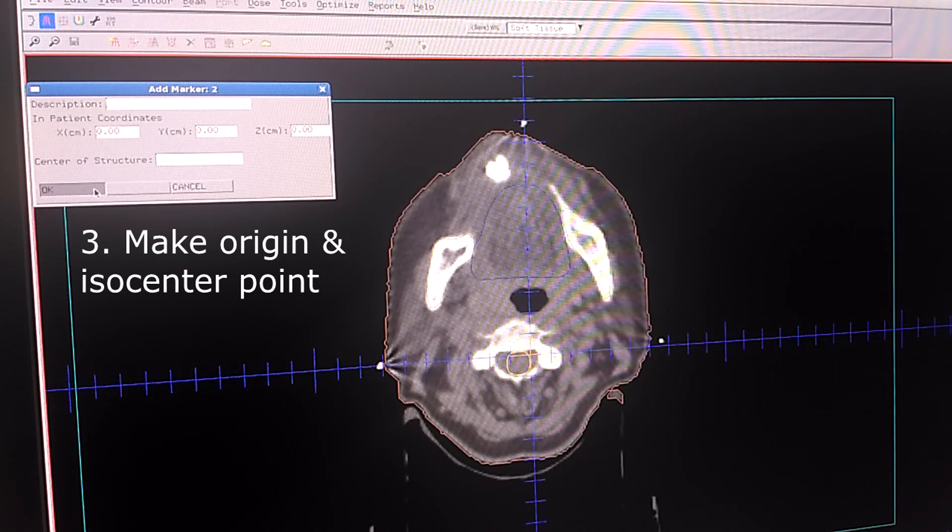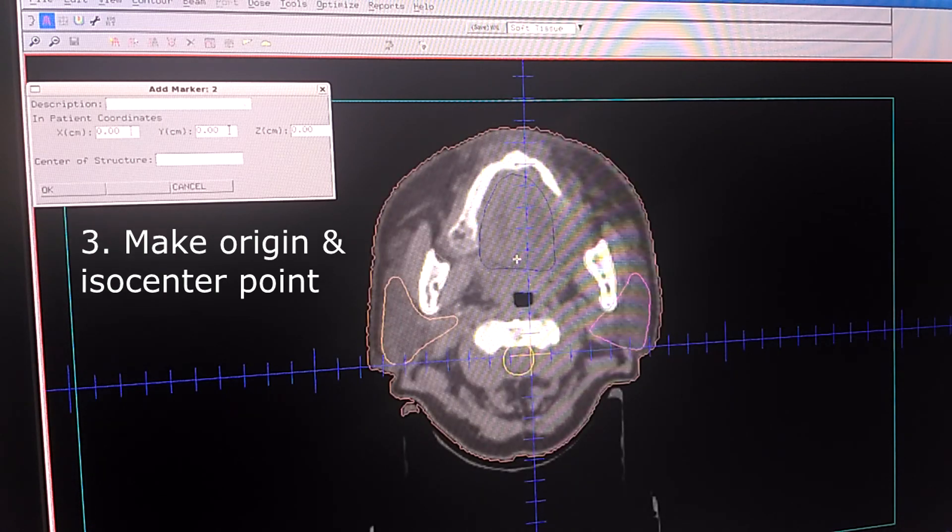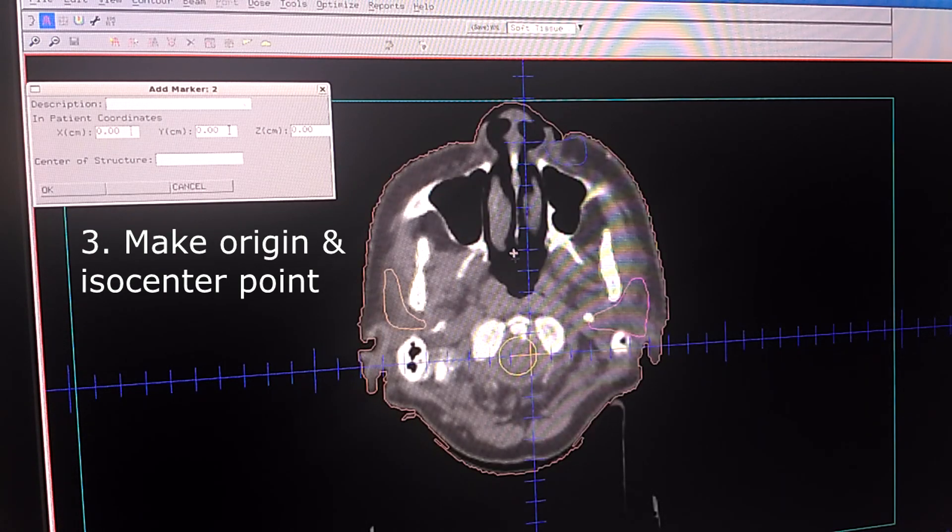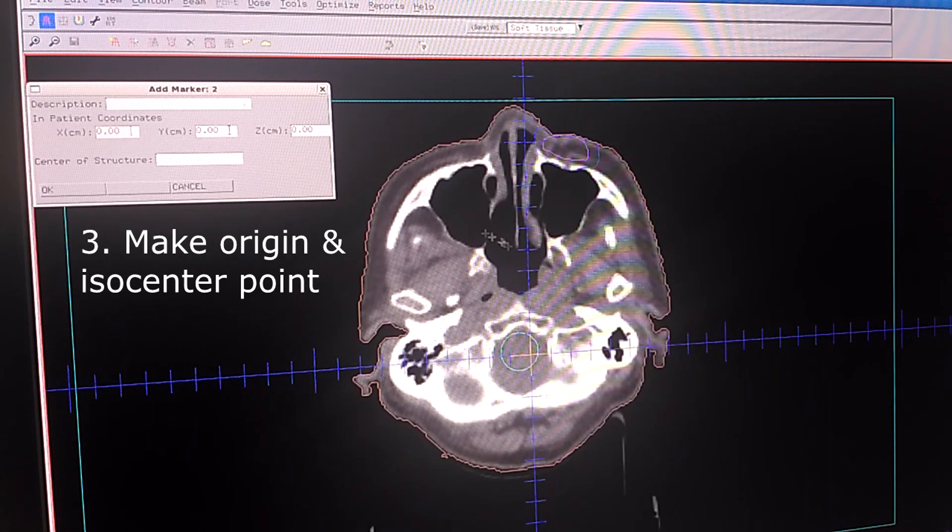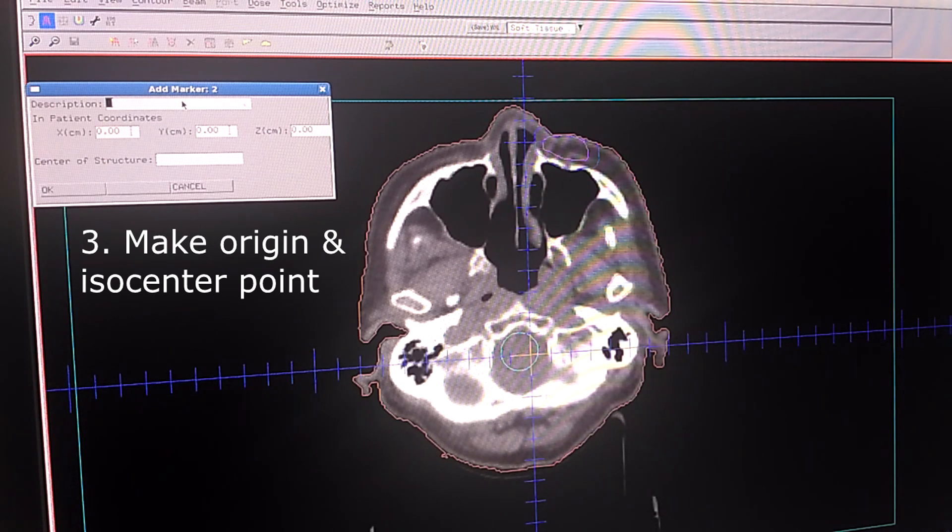Click OK. And then next we're going to make ISO center. Let's name it into ISO center in the center of PTV.